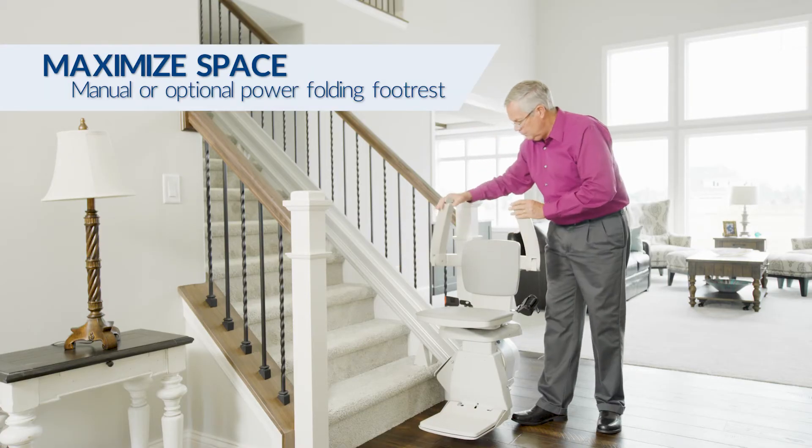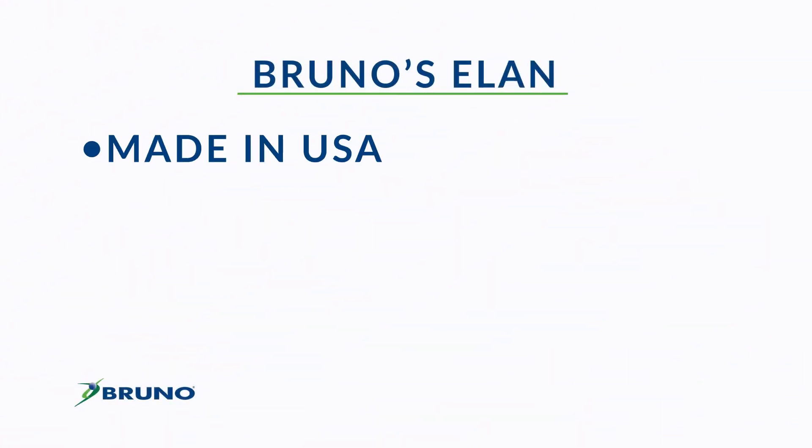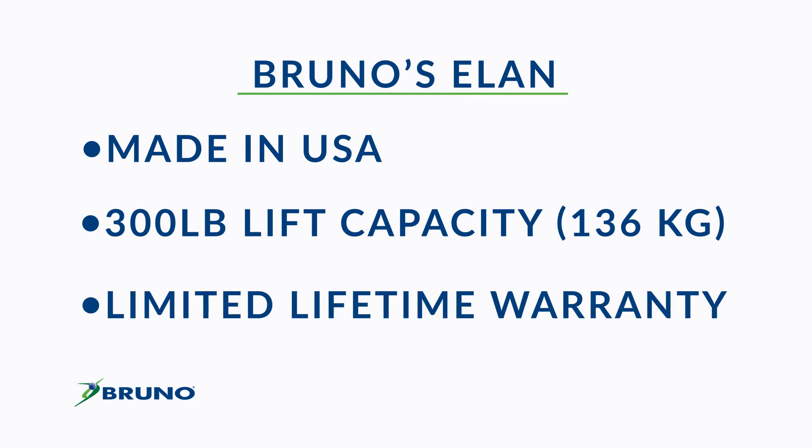When not in use, the Bruno Elan folds into an ultra compact profile. The Bruno Elan offers made in USA quality, a 300 pound lift capacity, and a limited lifetime warranty.